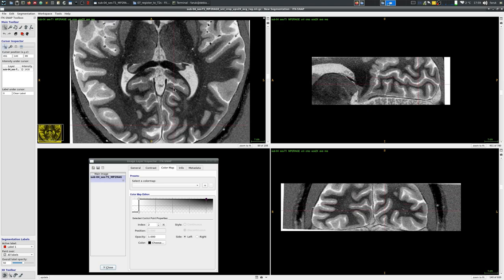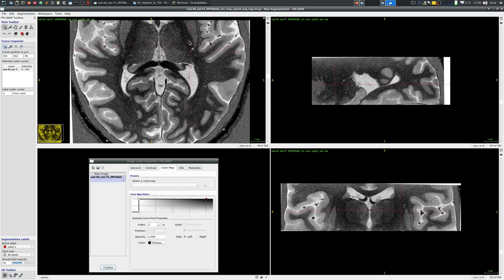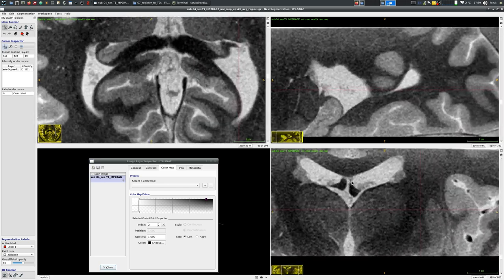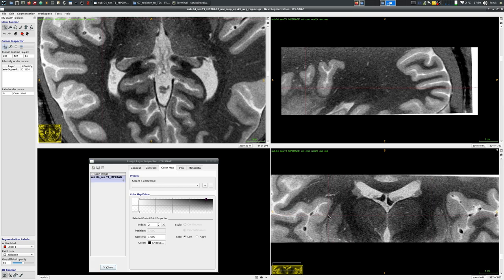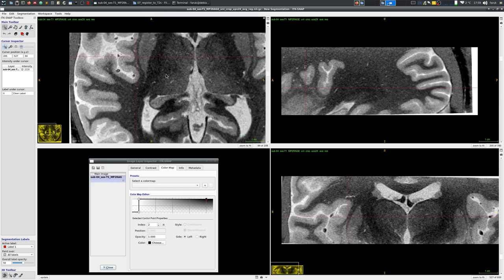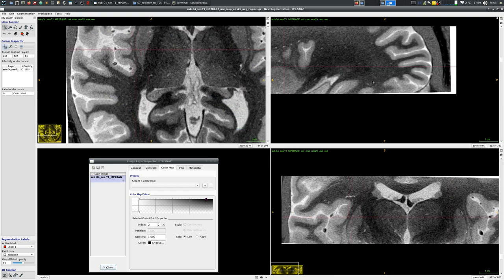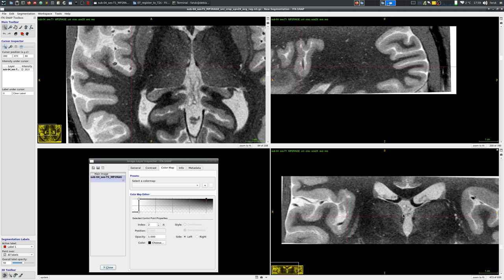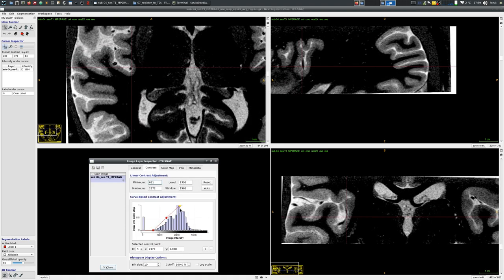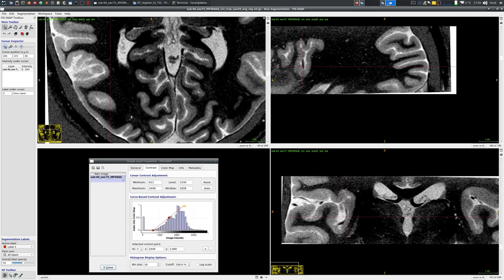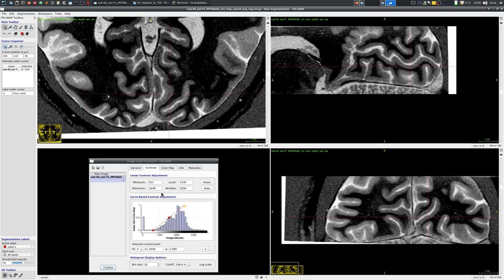Maybe it can be useful for looking at some structures in the subcortex. Of course the information is the same, but this is just an optimization for human eyes, so to say. We can change the minimum and maximum similarly to adjust the dynamic range.